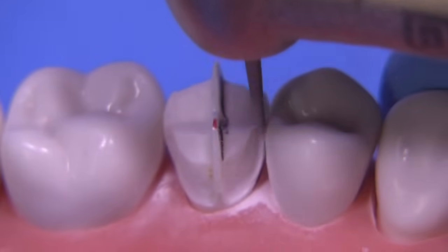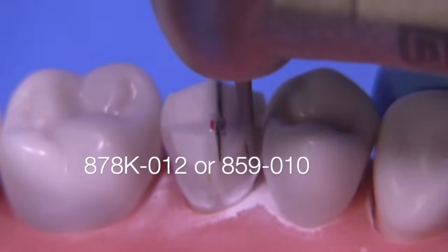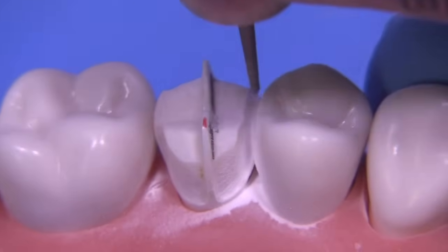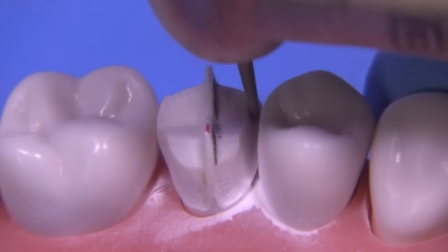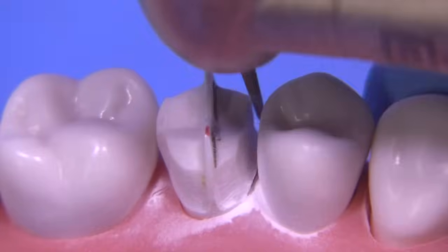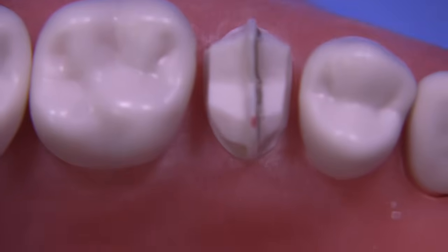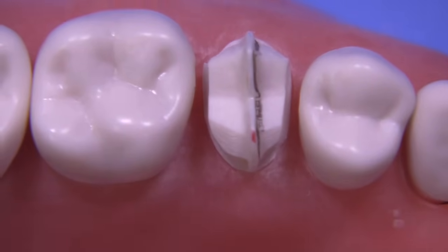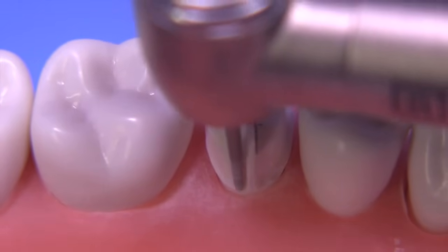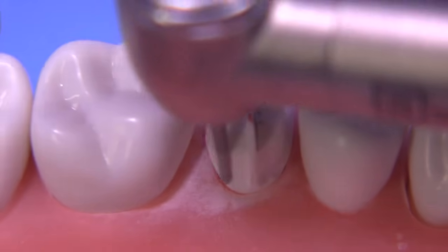For those of you taking examinations, sometimes you're not allowed to close the typodont together to check occlusion — I think this technique would be very helpful for those situations. I'm using the 878K to break through the proximal right now, but you could also use an 859 010 needle-shaped bur or other narrow burs to break through. Now it's just a matter of blending those axial walls to make them continuous. You want to hold the handpiece so it's following the long axis of the preparation.